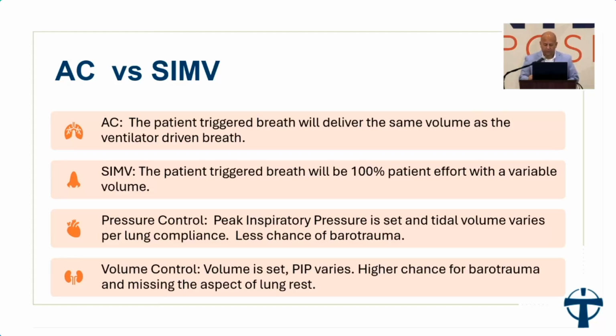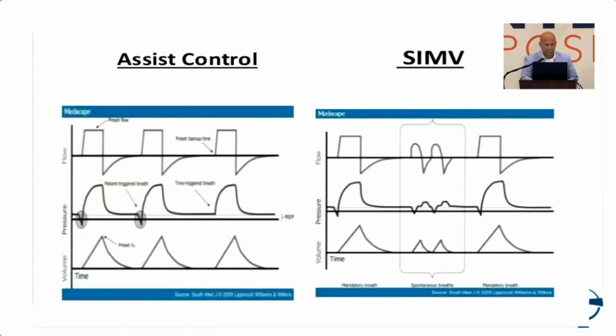become ECMO specialists. So if you look at these wave volumes, you look at assist control, and you see it goes up as inspiration and comes down as expiration. That's a very weird way to breathe. It's as if you're running up or down stairs, right? It's not very comfortable. Most patients are sedated, some are not.